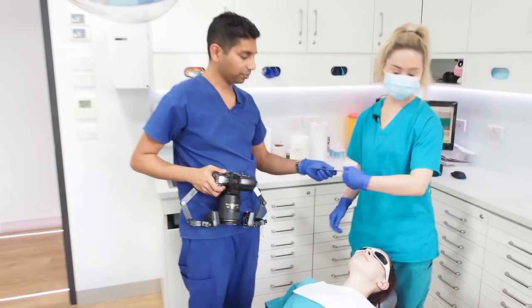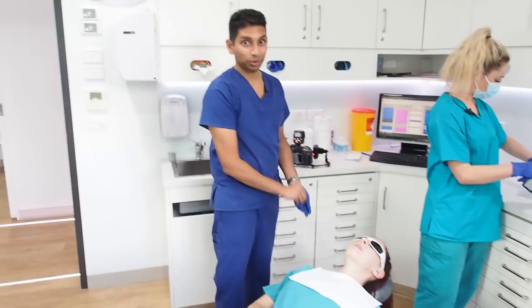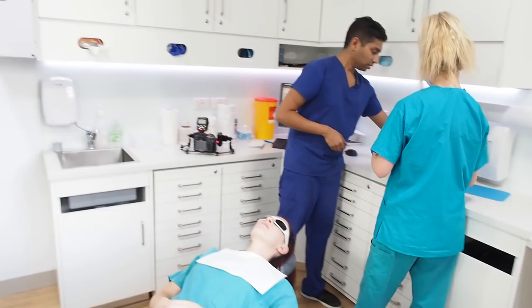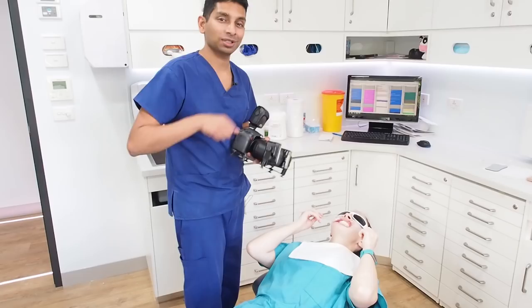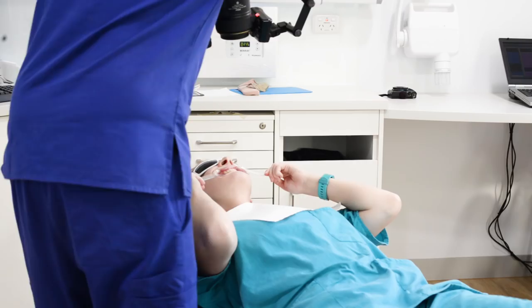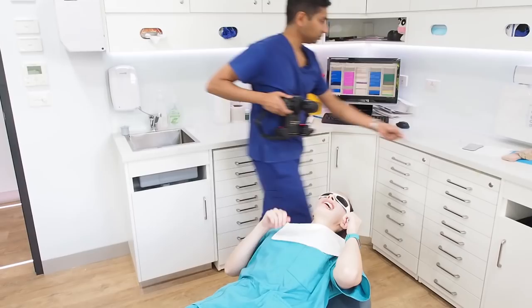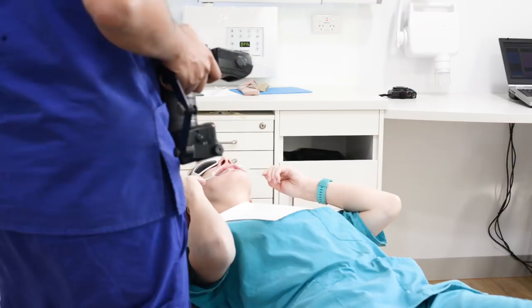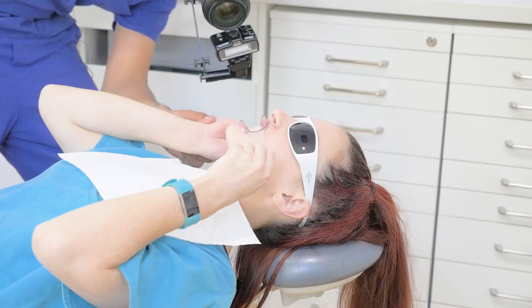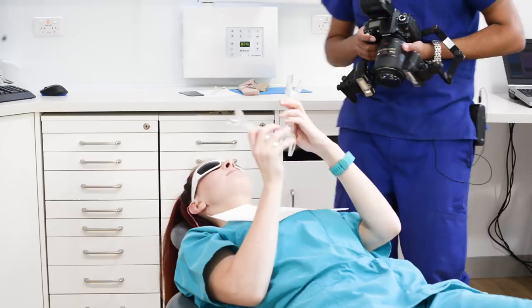If you want to do this without an assistant, it's also really possible — it just takes a little bit of patient education. You say: 'Would you mind grabbing these for me? Just pop them in your teeth like a snorkel, in between your teeth. Bite down together and stretch if you can.' Usually you get better photos this way because the patient knows how much they can actually stretch. Then swap to the other side retractor: 'Bite down together and just push it towards your ear.' Then switch them around and do the same on the opposite side.